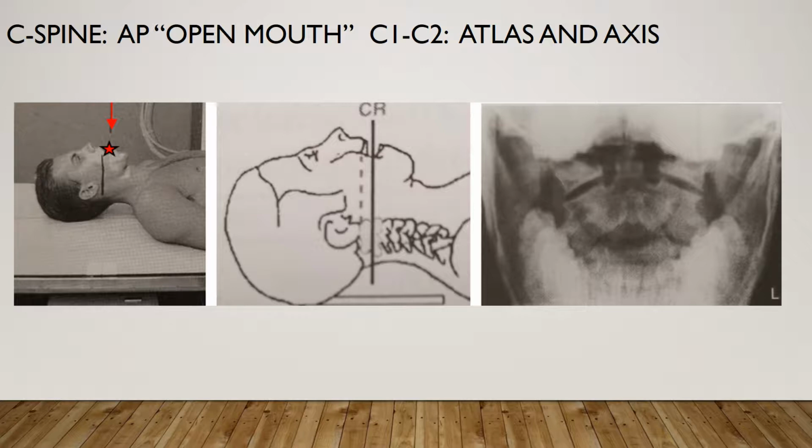Your upper incisors and base of the skull need to be superimposed. The entire dens is demonstrated within the foramen magnum. You want to have optical density and contrast with no motion. You want to have soft tissue and bony margins and trabecular markings sharp.